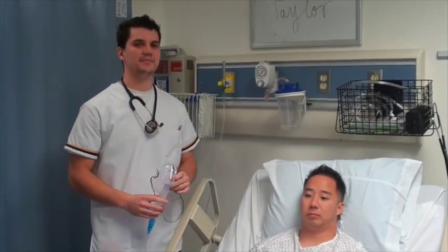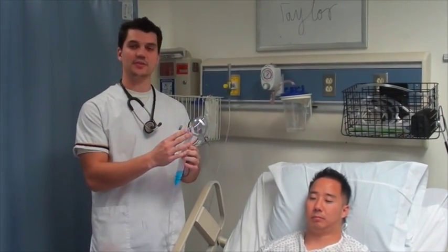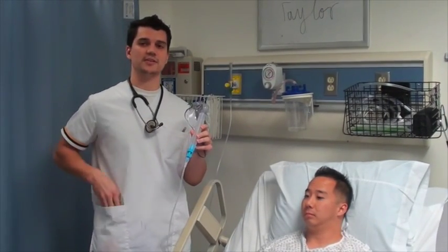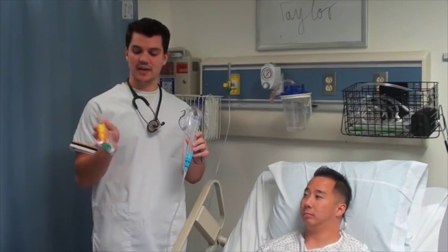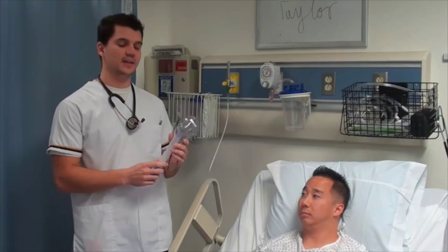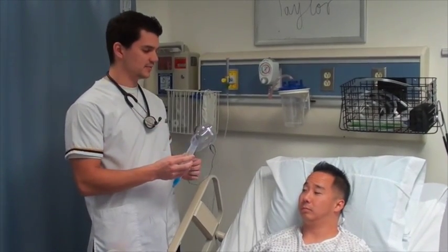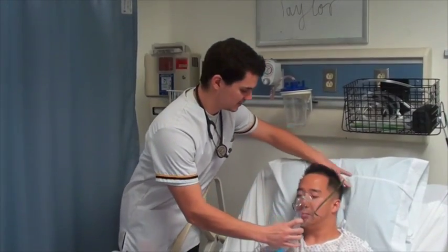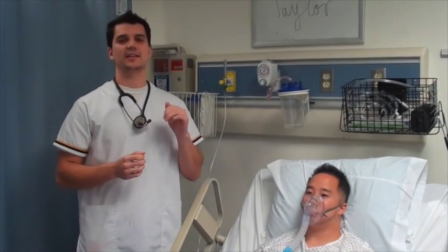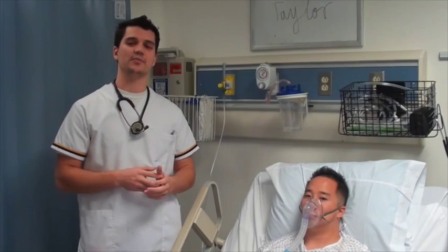Hi Josh, I am option number 4, and this is the Venturi mask. So this right here is the Venturi mask, and these are the Venturi barrels, also known as entrainment devices, and these are also the other attachments. The Venturi device is a lightweight, plastic, cone-shaped, form-fitting mask. It fits on just like this onto the patient. The great thing is that it delivers a precise O2 flow in a variety of rates.